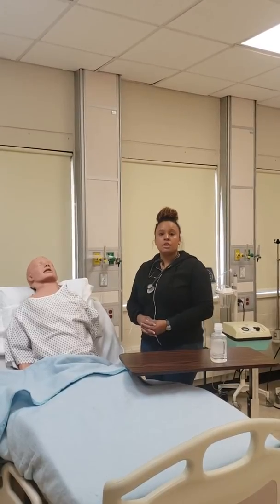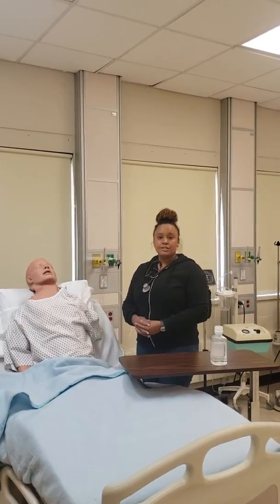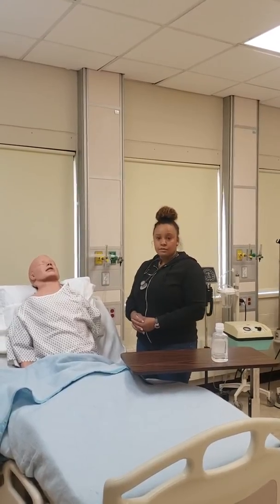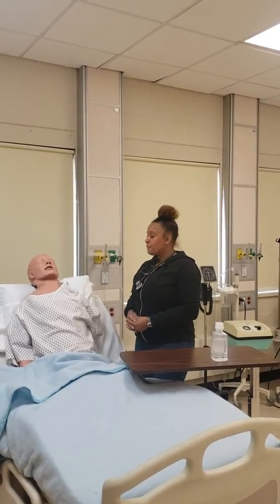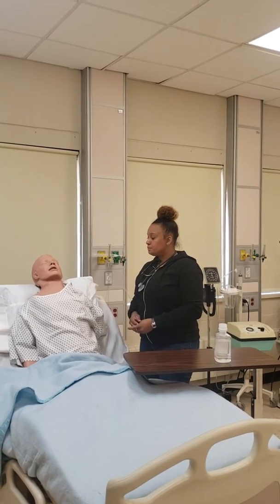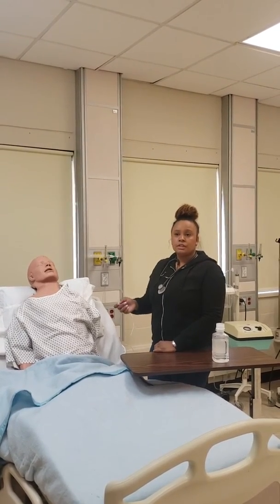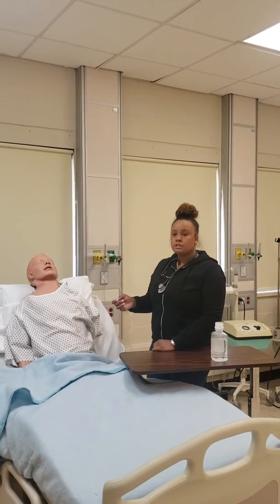remeasure the patient's pulse, respiration, saturations. I will assess the patient's color, level of dyspnea, and breath sounds. And note if there is any unexpected sounds by lobes and segments.